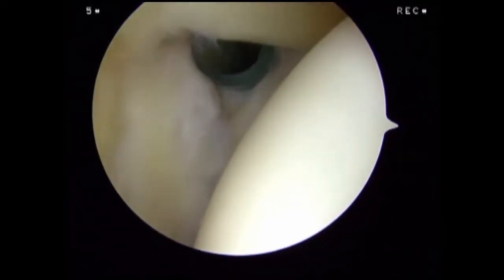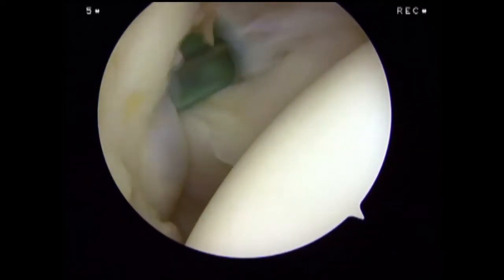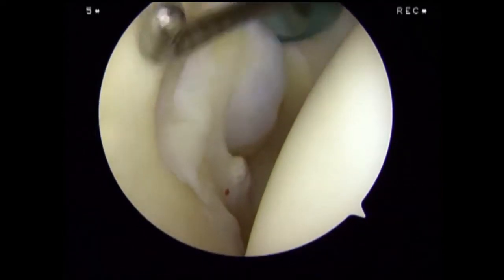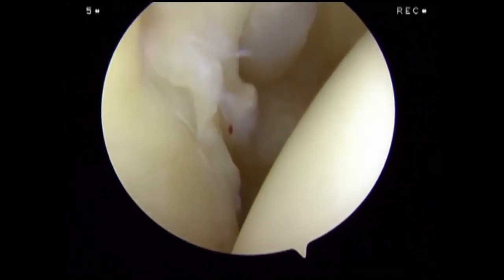We rotate the arthroscope inferiorly to examine the middle glenohumeral ligament. We can assess the subscapularis tendon, which is immediately anterior to the middle glenohumeral ligament. We then drive the arthroscope anteriorly and inferiorly to examine the anterior inferior labrum and glenoid cartilage.